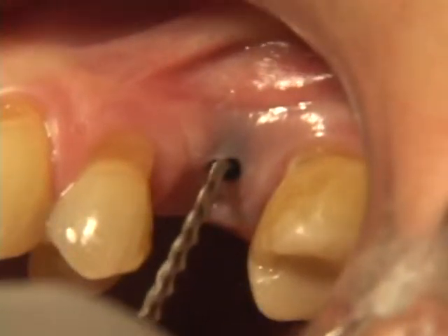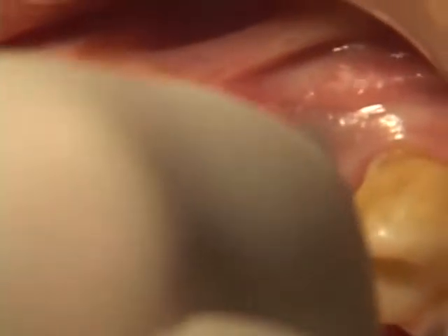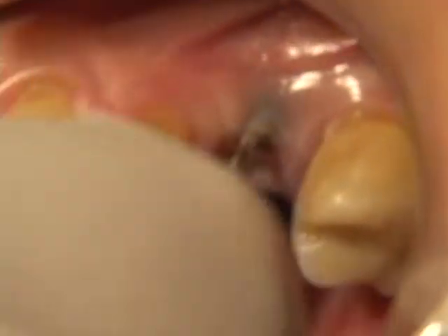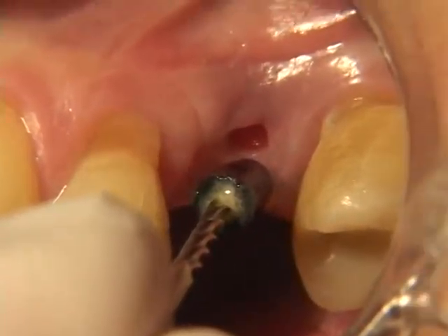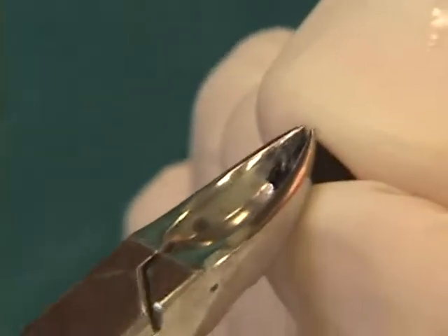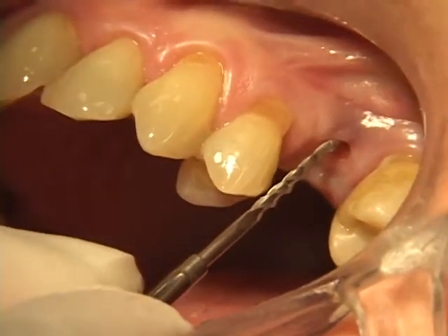If a sharp edge were to be left on the plug, it may act as an irritant to the mucosa, resulting in an operculum-like fenestration, often with a slight purulent exudate. Polishing and reinserting the plug usually resolves any soft tissue irritation.